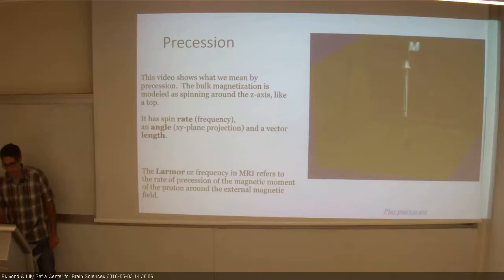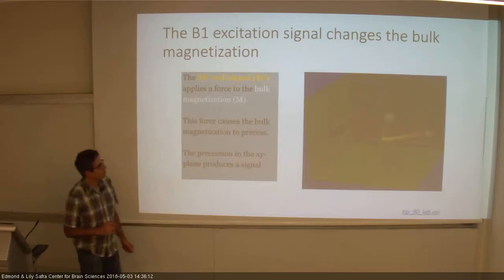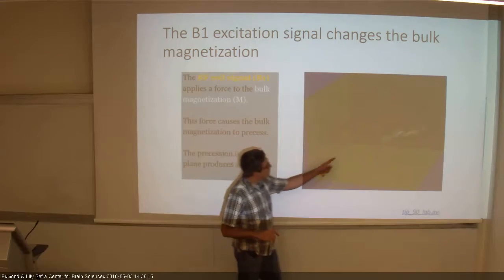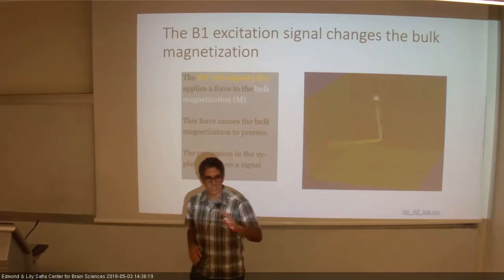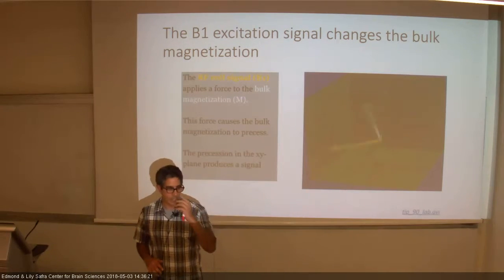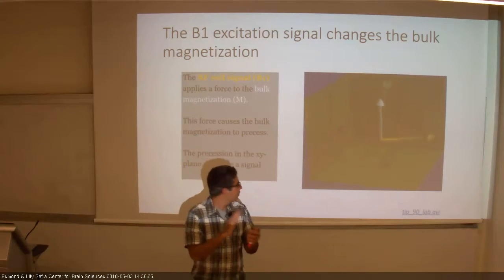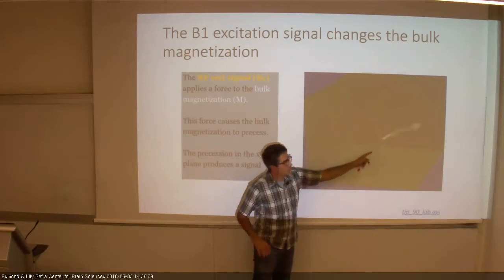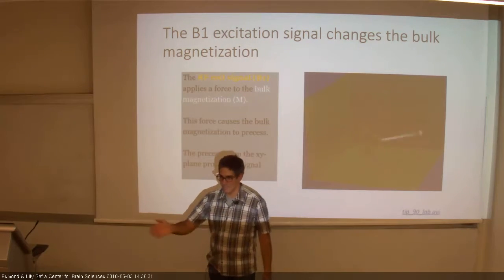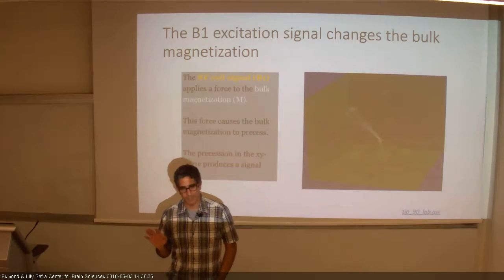And in the next step, what I told you is that we're going to excite. So we're adding another pulse. This pulse, I didn't talk about it, and I'm not going to. It's actually also moving in space. Now this is the excitation, and so I'm pushing the vector toward the xy plane. More and more is now projected toward the xy plane, and that will be useful for us for a measurement soon.